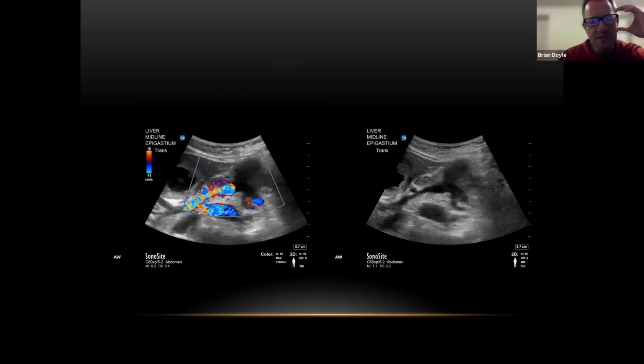So Alan, my guess is you clearly knew something was wrong, much like I knew there was something not right, and ordered a CT or something. Yeah, it was one of those situations where it did expedite things, in that instead of just doing an aorta scan, someone who doesn't do ultrasound might have said, let's just get a CT abdo, right? But then you would have seen this, and you would have to go back and say, well, we're going to need a chest, we're going to need a brain, we're going to need to do some staging maybe. So I could order a pan scan knowing that I'm ordering a pan scan for a good reason, which is to stage it.